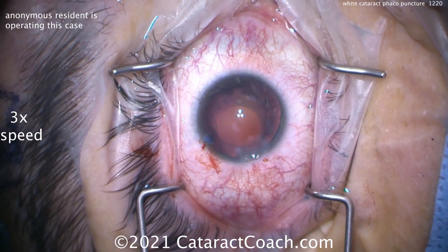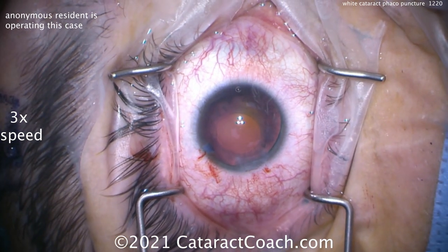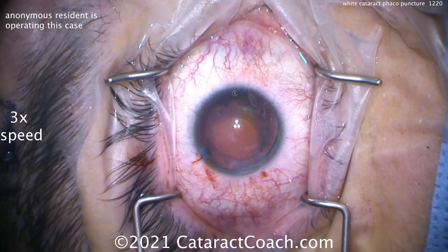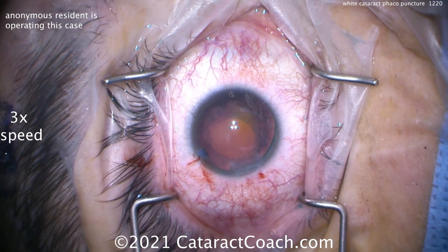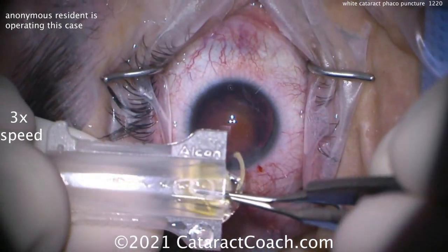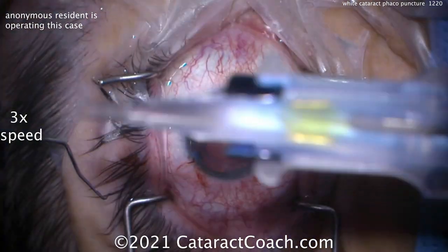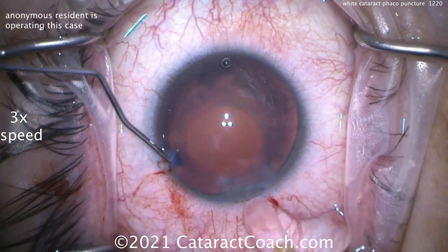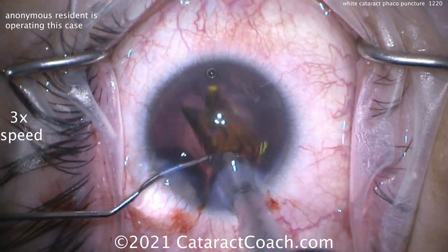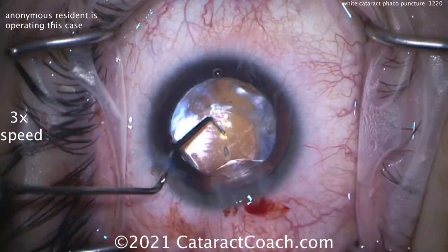The resident is going to load this lens. This patient had a cataract for an unknown reason, no trauma or anything of that nature, but we can certainly help the patient a lot. Remember to check on the pre-op exam whether the patient has any sensory exotropia. This patient has a retrobulbar block so the eye is pretty frozen, but there was a little bit of sensory exotropia because the white cataract was present for almost a year without surgery. You've got to warn the patient they're going to have some post-op diplopia, which should resolve within the first couple of weeks. Now here comes the lens — getting it right inside that small capsular opening and into the capsular bag.